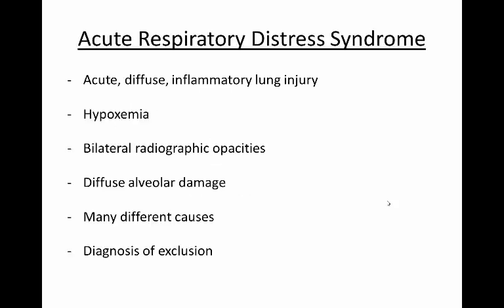Acute Respiratory Distress Syndrome involves acute, diffuse, inflammatory lung injury that leads to increased pulmonary vascular permeability, increased lung weight, and loss of aerated tissue. Hallmarks of ARDS include hypoxemia and bilateral radiographic opacities. The underlying lung pathology is diffuse alveolar damage.